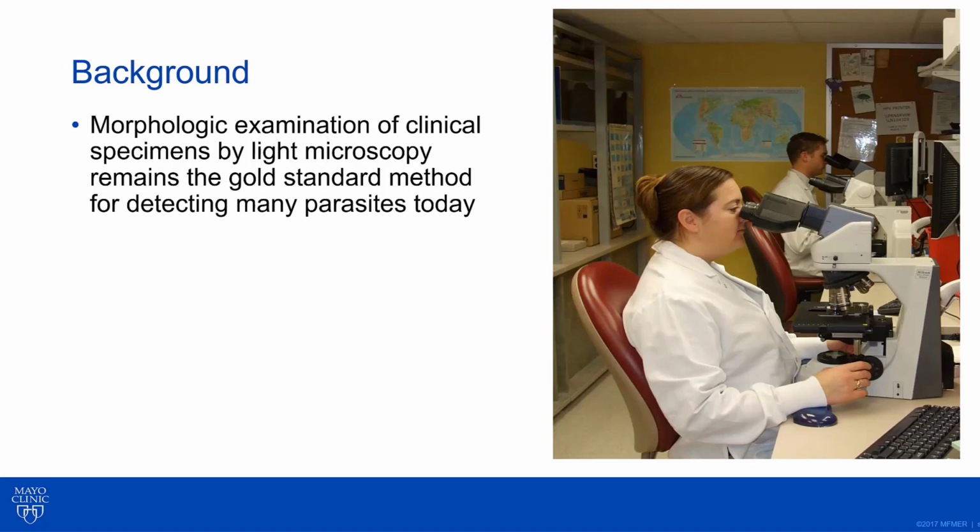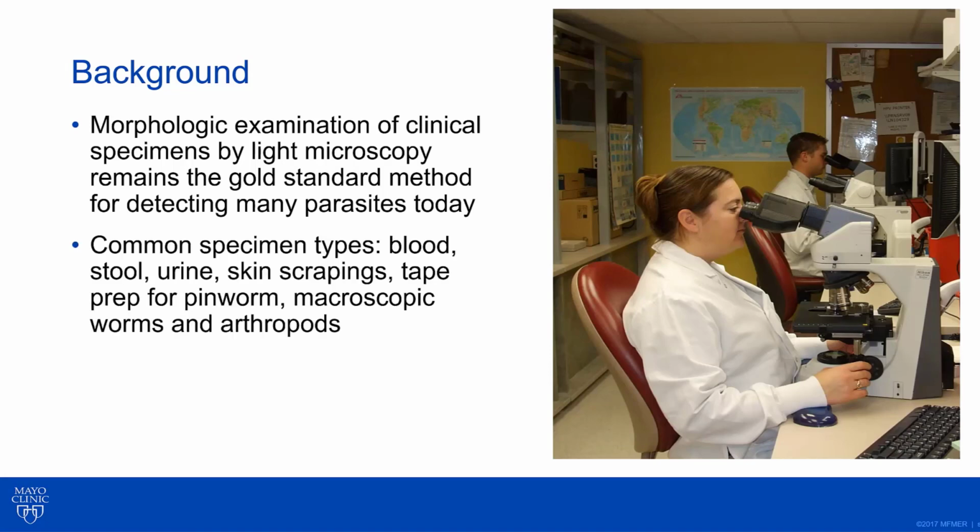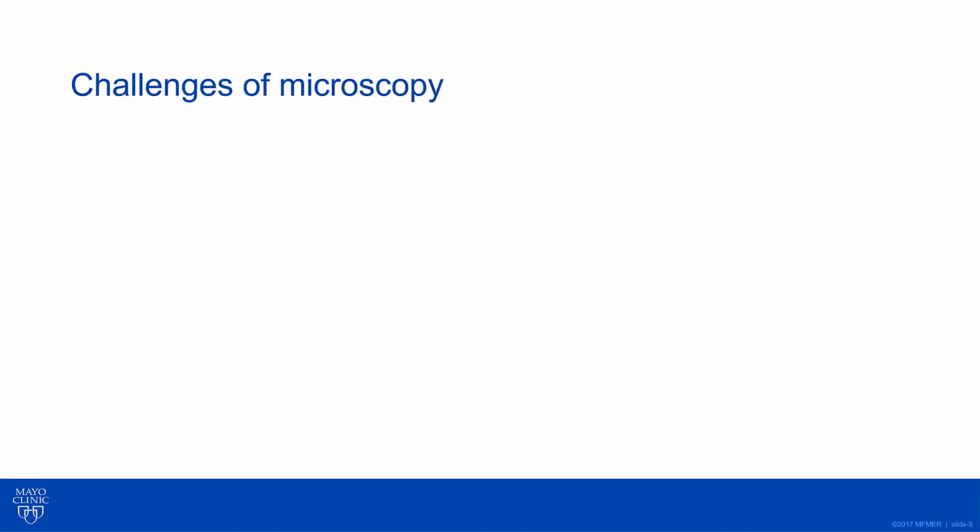And on a busy day, we will have 7 or 8 individuals all sitting at their microscope for the entire shift. Common specimen types, I mentioned blood and stool. There's also urine, skin scrapings, tape preparations for pinworm, and then we also get a good number of macroscopic worms and arthropods for identification. There are challenges to microscopy, however.